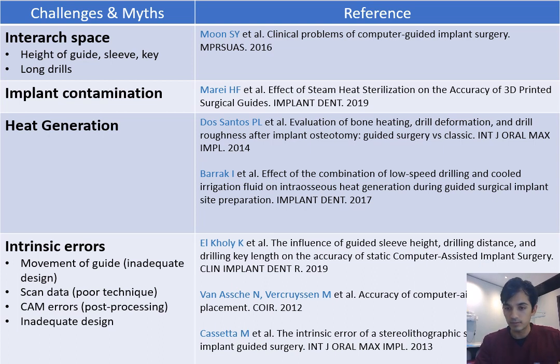The first thing being interarch space. That's probably the biggest question we get when we show a digital case at a presentation or at a forum. People ask, in the posterior area, will your digital drills fit? Can you use a guide? Does it take up too much space intraorally? So let's look at that.